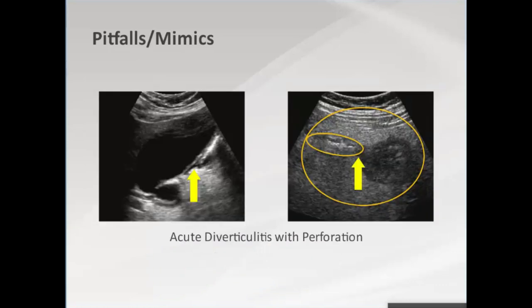Another patient, rule out acute cholecystitis: the gallbladder is distended with no stones and some pericholecystic fluid, but maximal tenderness was inferolateral to the gallbladder. Placing the probe in the region of interest revealed a thickened hepatic flexure of the colon with an inflamed, perforated diverticulum and a little jet of extraluminal gas — acute diverticulitis of the hepatic flexure mimicking acute cholecystitis.